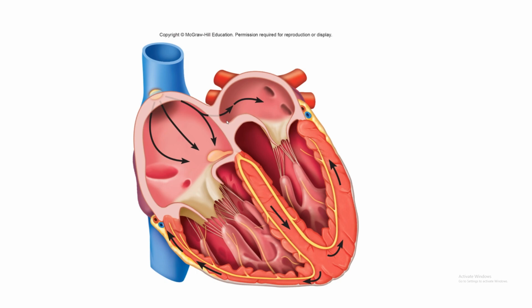What you see on your EKG strip, and how you identify atrial contraction on the EKG strip, is your P wave. As the left and right atria depolarize, the conduction goes through the right and left atria and causes atrial contraction, and that would be your first little blip on your EKG strip, your P wave. After you get your P wave and the electrical signaling goes through all of this tissue, it meets the AV node. When the action potential gets to the AV node, there's going to be a little bit of a pause.